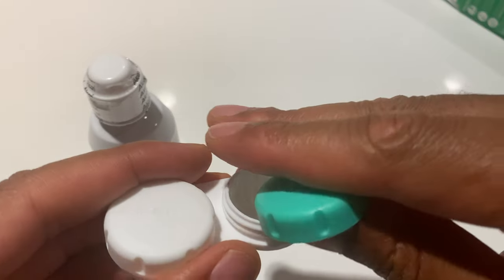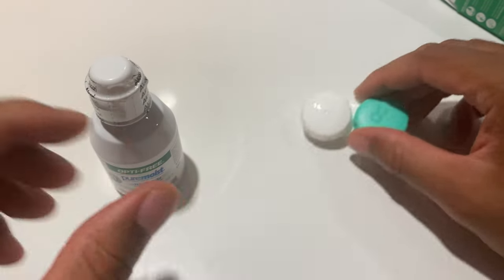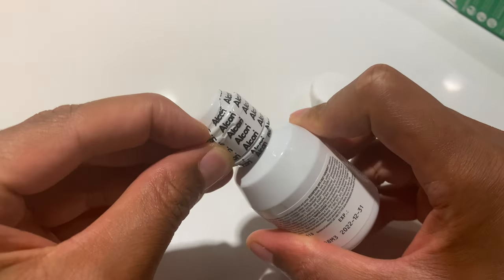Put that on. Smells fresh. Then I'm going to go ahead and open up the solution and show you what the bottle looks like once you open this up.